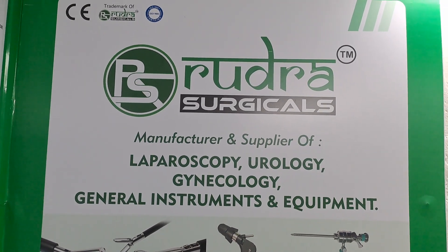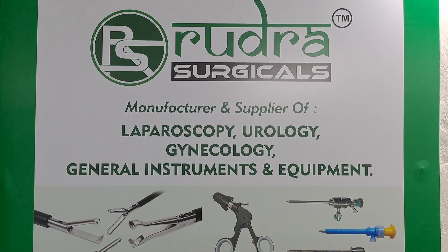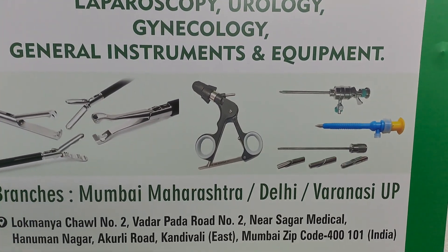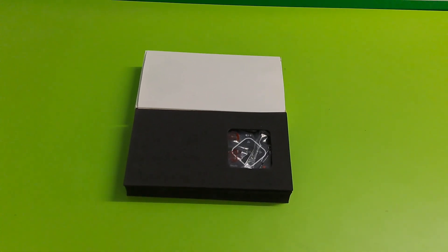Hello, welcome to Rudra Surgical. We are manufacturer and supplier of laparoscopy, urology, gynecology instruments and equipment. Now we are showing HD video recorder.